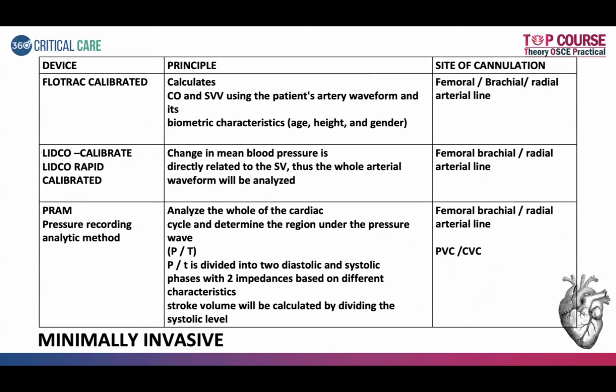FloTrac usually calculates the cardiac output and the stroke volume variation with the patient's arterial waveform as well as the baseline characteristics of the patient. All we need is an arterial line. And then LiDCO, which uses this pulse power technology, could be an internally calibrated or externally calibrated version. Both use changes in the mean blood pressure related to stroke volume, and the whole of the arterial waveform is analyzed.